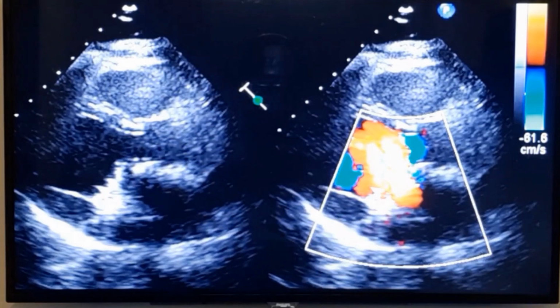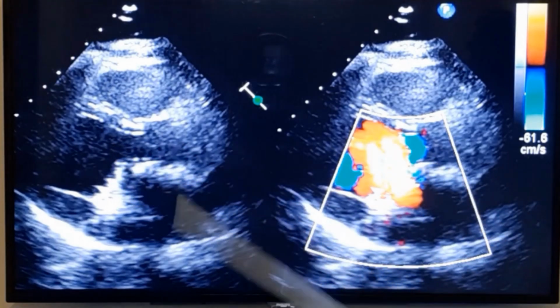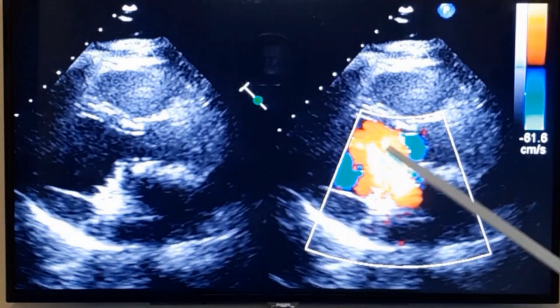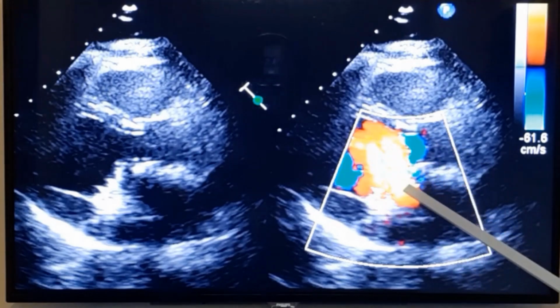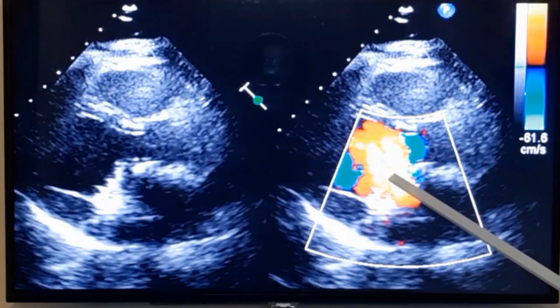This is the way it is going, almost to the immediately lower part below the left ventricular outflow tract. It's an eccentric flow. Usually mitral flow will be in this direction. So this direction is because valve leaflet is kept open in this position. And you can see the dense turbulent flow. You see, normally if it's a normal mitral valve, it will be only a laminar flow. But in prosthetic valve, usually it is not a laminar flow. The gradients are slightly higher than normal. This is a normal flow. It's not an abnormal flow across a prosthetic mitral valve.